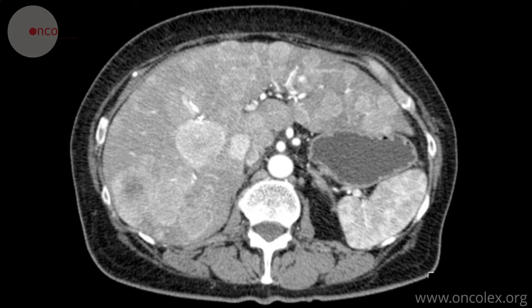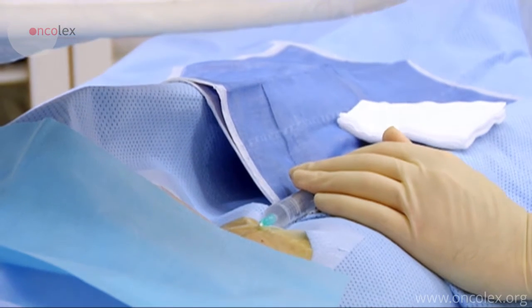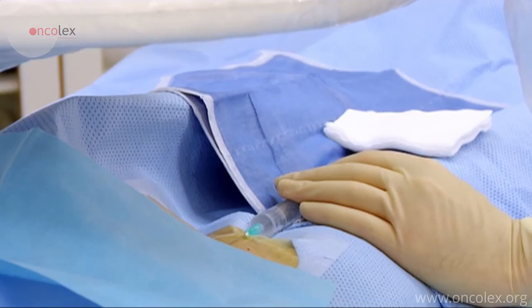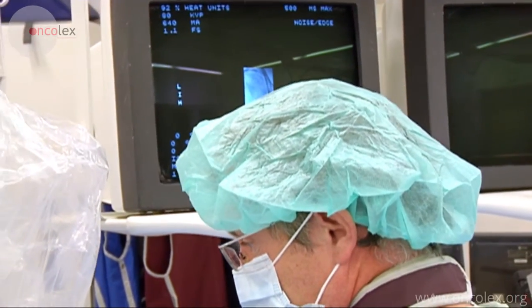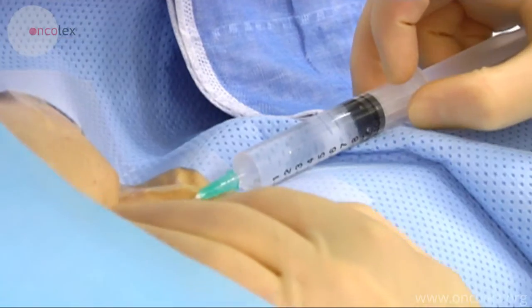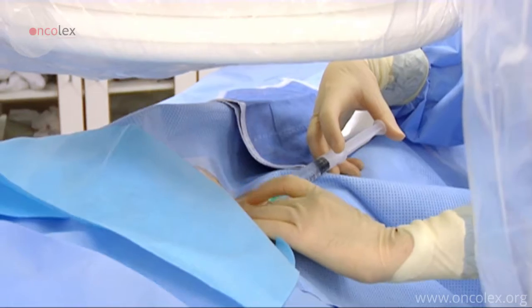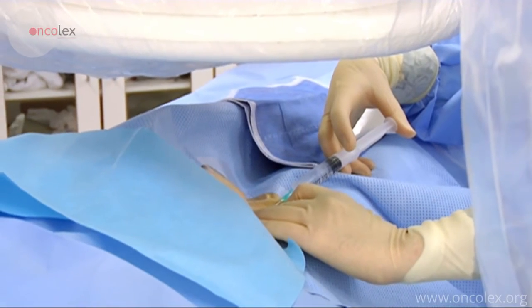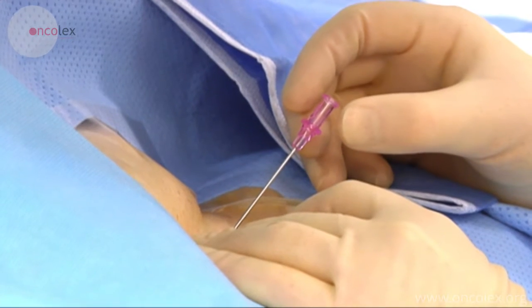The catheter is inserted into the hepatic artery via the femoral artery. The radiologist begins by administering local anesthesia. The needle is placed over the puncture point and the placement is checked with fluoroscopy. Local anesthesia is administered to the area around the puncture point.